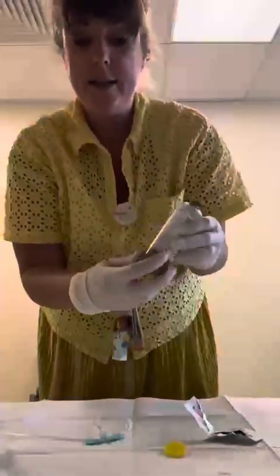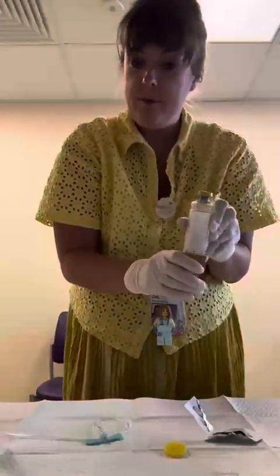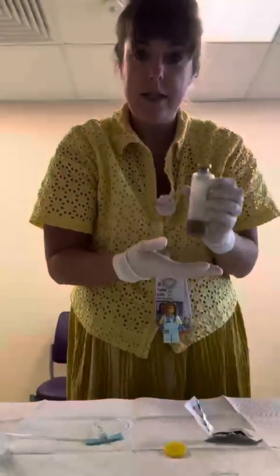Make sure you've printed and scanned your labels and labeled it appropriately. You're going to double bag it with a red specimen bag and send it to the core lab. And then we'll see what grows.